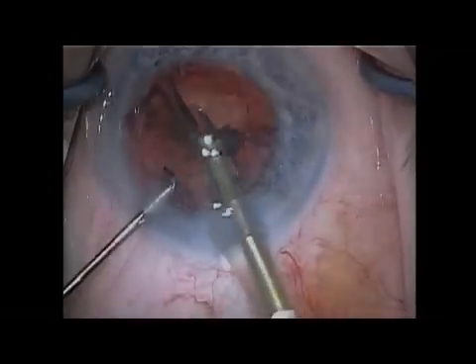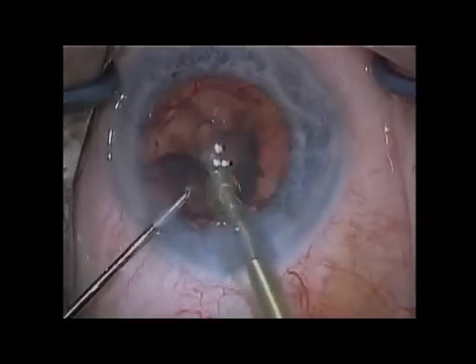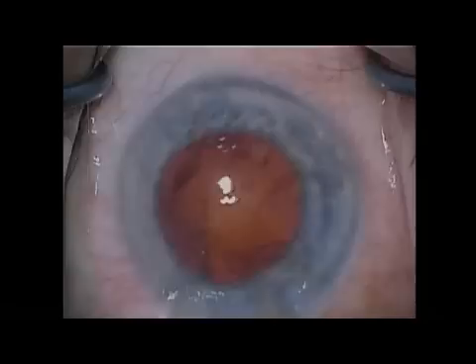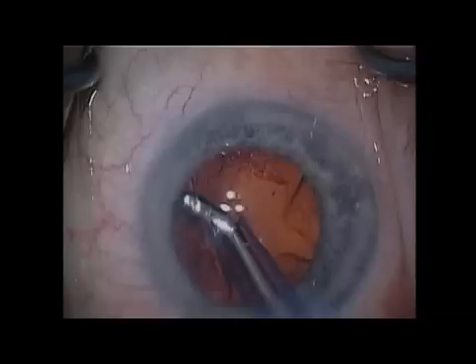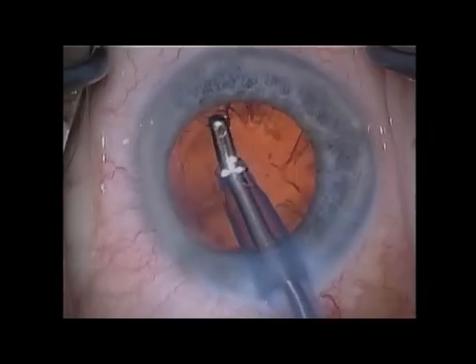The other area where it makes a difference is actually inside the capsular bag. You can actually see different levels within the bag itself. You can see the undersurface of the anterior capsule better. You can see debris on the posterior capsule, as well as in the anterior vitreous space. So it's really quite impressive.